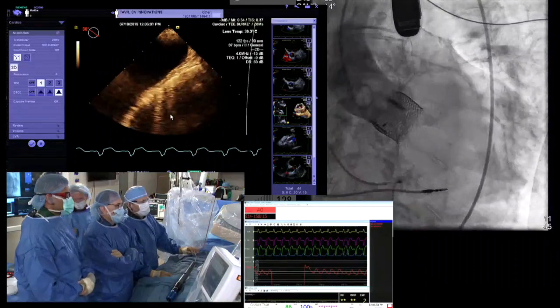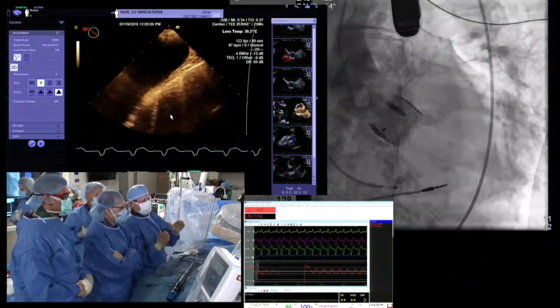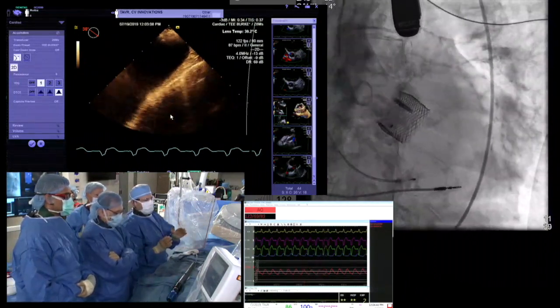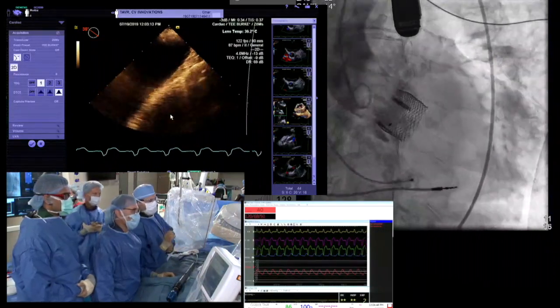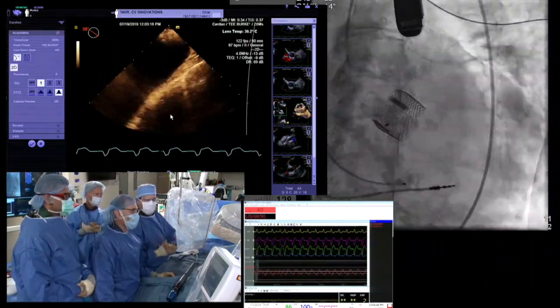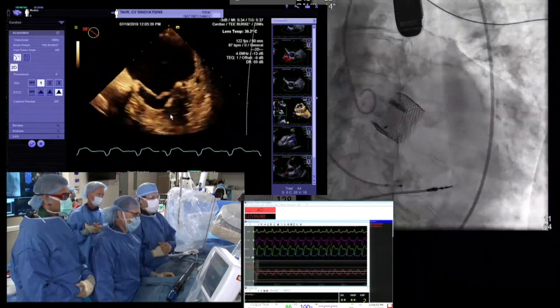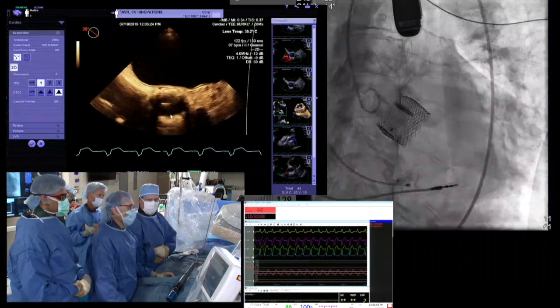Congratulations, David. Looks perfect. That's really nice. I love the depth. The tuning forks are sitting really at the base of the annulus on the left-hand side. It's perfect. The old-fashioned way, old-fashioned meaning a year-old way of making that central marker, would have been in the middle of our pigtail. So I think that everything here is about exactly where we want it. We're below our coronaries, so reaccessing our coronaries should not be a problem.